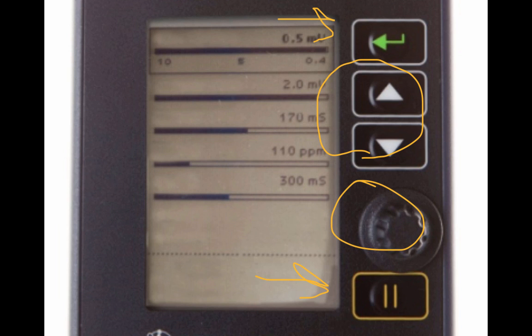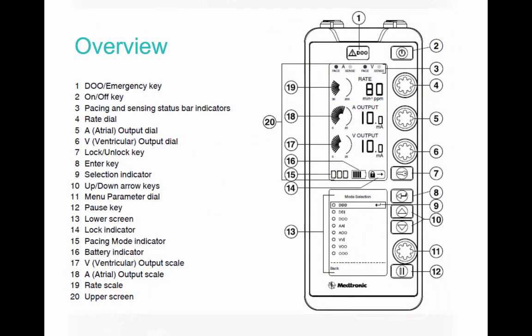This is your pause button, which will allow you to look at the patient's intrinsic cardiac rhythm for a period of 10 seconds. Here's a little bit more detailed overview of the 5392. If you want to pause at this point to take a look at that and review each of these components in greater detail, feel free to do so now. Otherwise, we're going to keep moving along.